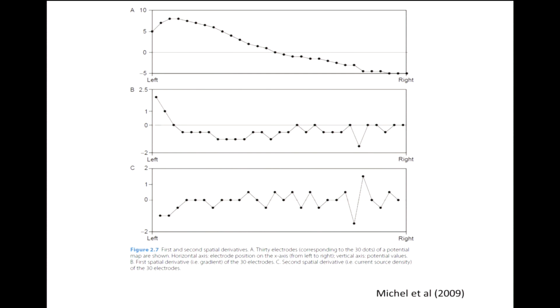Now you have to measure the first derivative. The first derivative is nothing but the first difference. Suppose at this electrode you are only measuring this one minus this one, or actually you can do this minus this, this minus this. So that's the first derivative at the first electrode. You just subtract the neighbor from its current value. So this is the gradient, and if you take the gradient, another first derivative, then it becomes the surface Laplacian or the second order. So that's the very simple formulation.